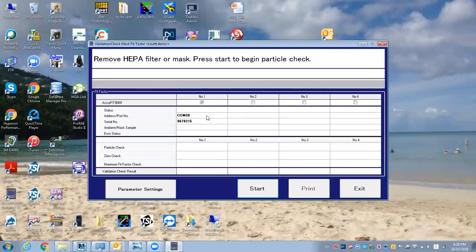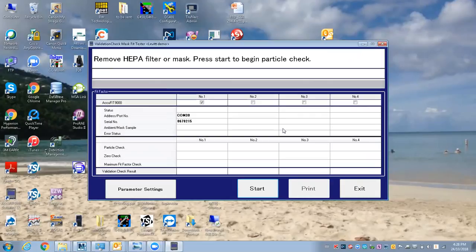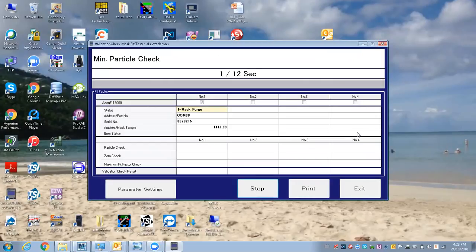You can see I've got one AccuFit connected, but I could have up to four, so I'd be able to test four people at a time. I don't have a particle generator running—the humidifier running with a salt tablet.